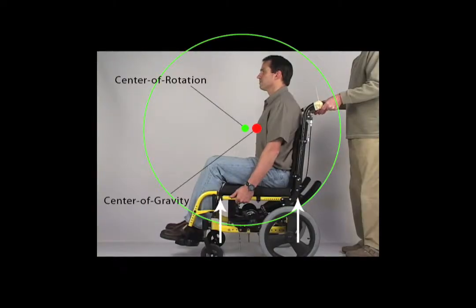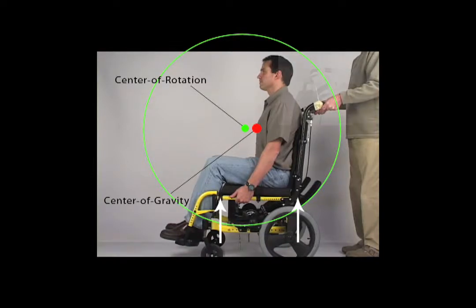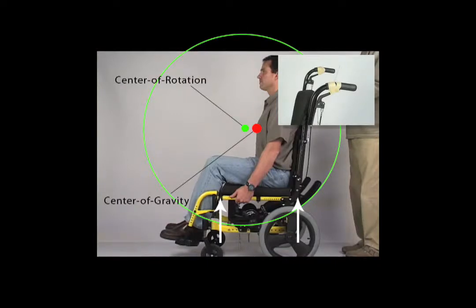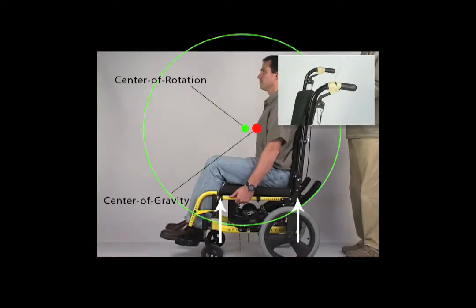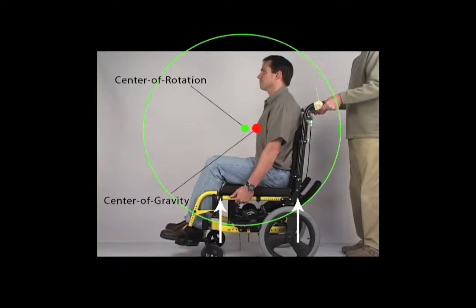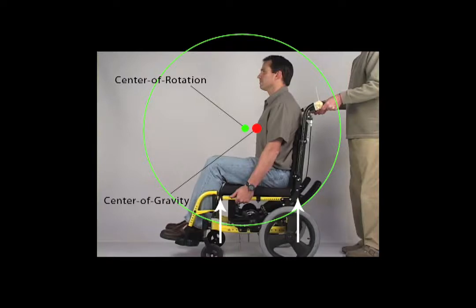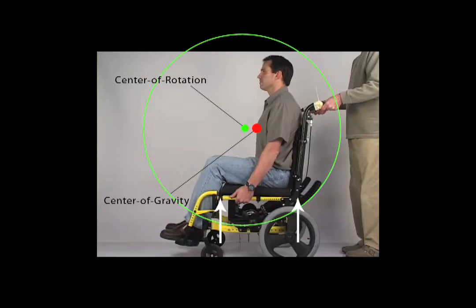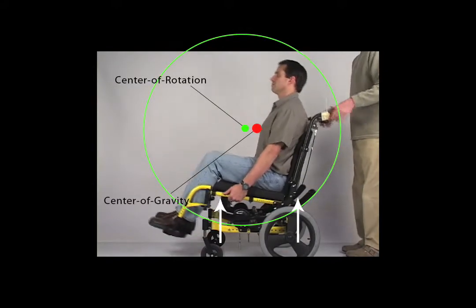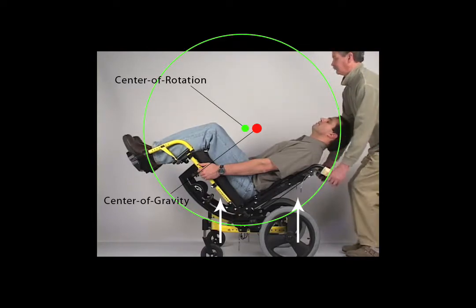First, let's discuss the adjustment of center of gravity and center of rotation. In this example, the tilt mechanisms have been disabled, so the system is free to rotate. We will also maintain the seating setup — the position of the backrest relative to the footrest will not change. In the first example, the center of gravity is behind the center of rotation. As a result, when support is left on the chair, it falls automatically into the most tilted or rotated position.